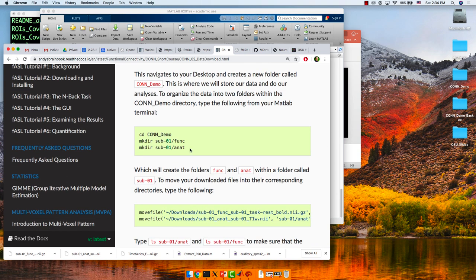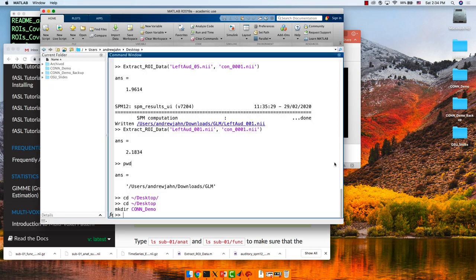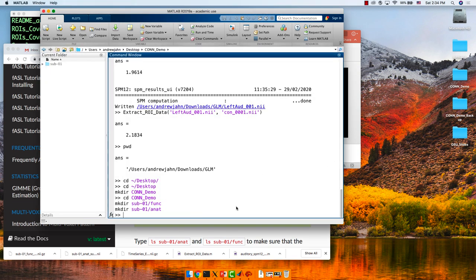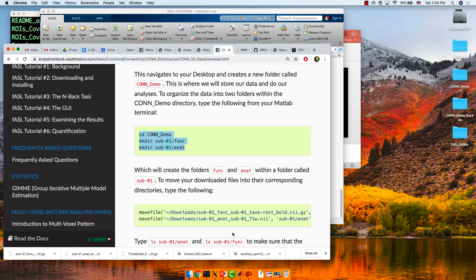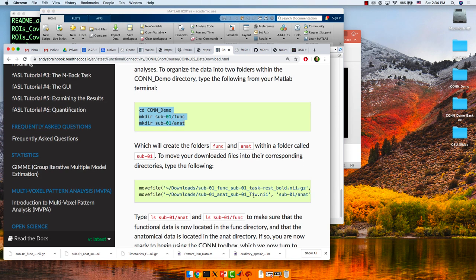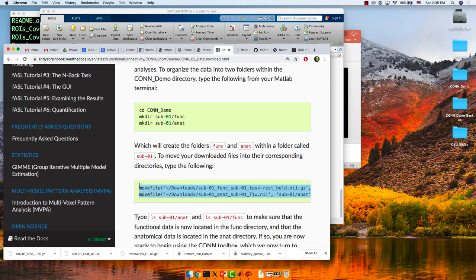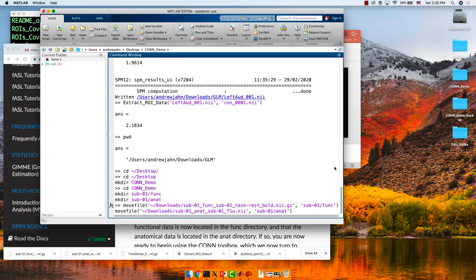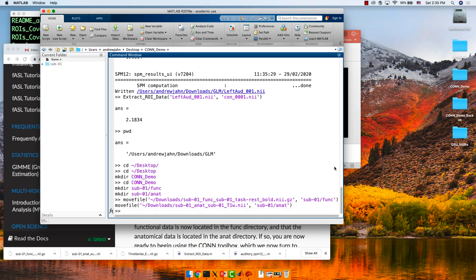The next code snippet navigates into the ConDemo folder and creates a couple of new directories: sub01/func and sub01/anat. We're mimicking the BIDS data structure because we've just downloaded individual files. Then there's a move file command — this assumes your files automatically downloaded to the Downloads directory. Copy and paste that and it should move everything into your directories.